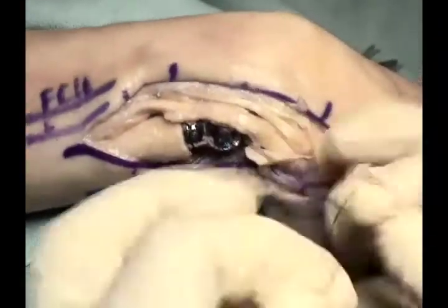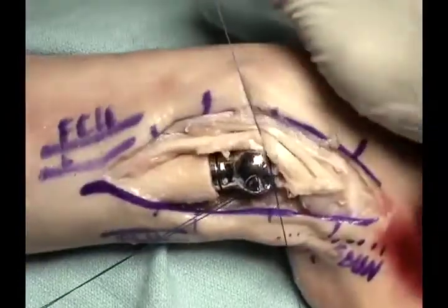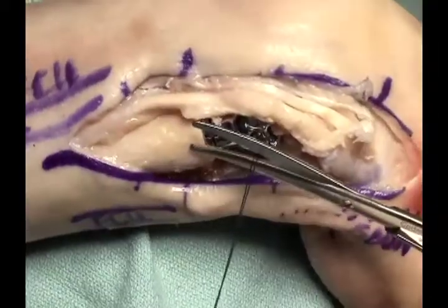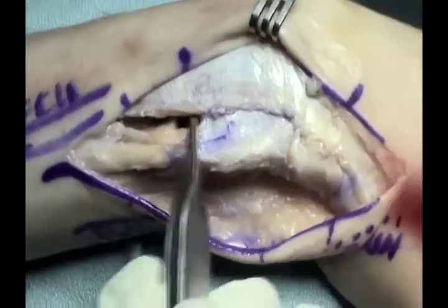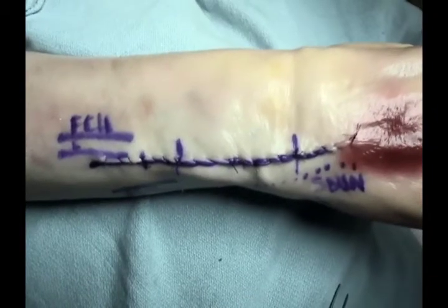The sutures are tested through a range of motion and then tied. The capsule is further repaired once the TFCC has been repaired to the head. A secure repair is performed so that the ECU remains dorsal. The wound is closed in layers and a long arm cast applied.